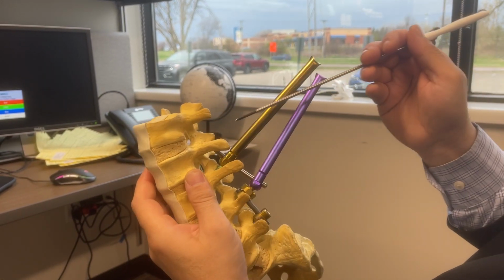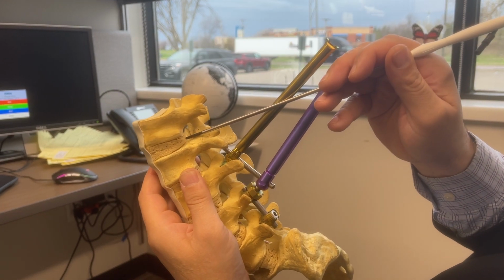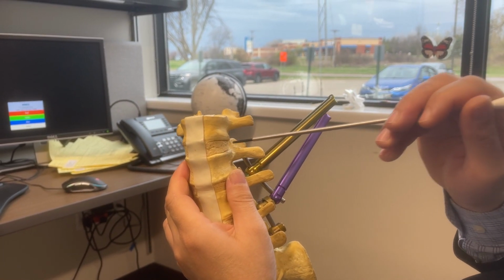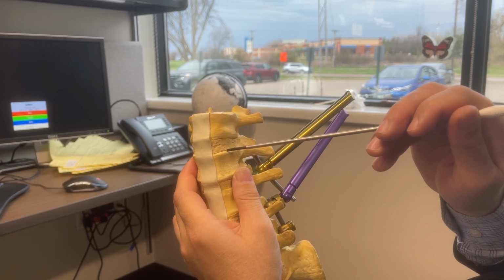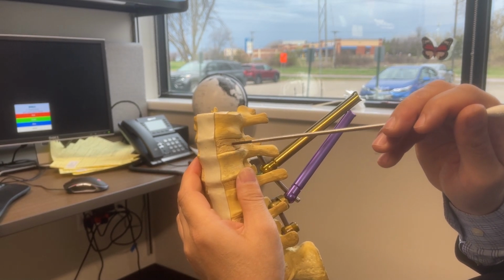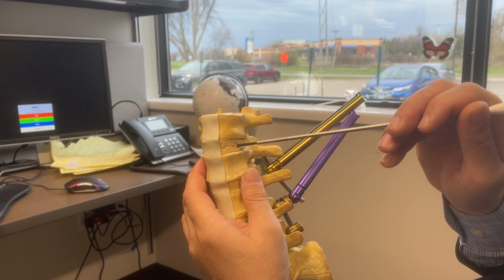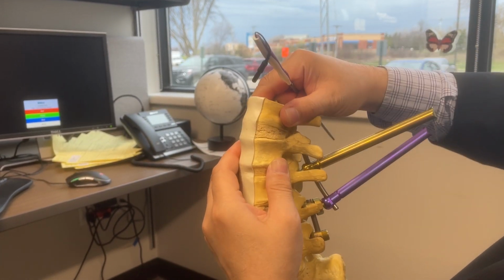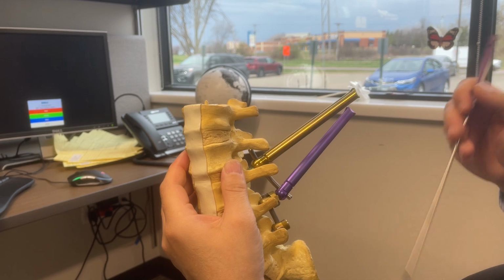With a technique that we call prone lateral or MIS DLIF, MIS direct lateral interbody fusion, we don't go through the Kambin triangle. We go through the psoas, and then I can put the cage directly almost on the epiphyseal ring, anteriorly through the psoas muscle, and then correct for sagittal deformity.